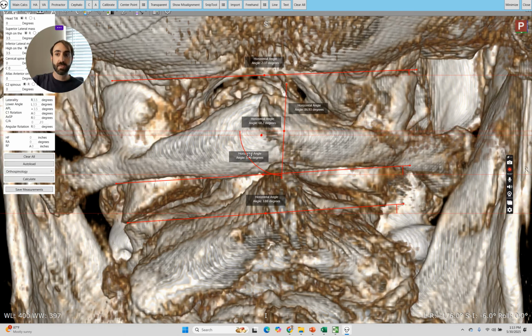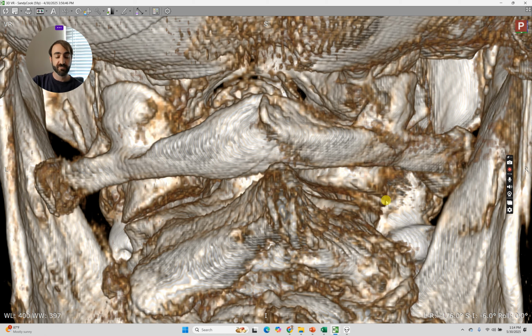And so by being able to kind of jump back and forth into the viewer, we can increase the amount we're actually seeing of the cone beam, the amount of data we're getting, and that's the whole point of cone beam. So anyway, the next thing we're going to take a look at is going to be that axial circle.